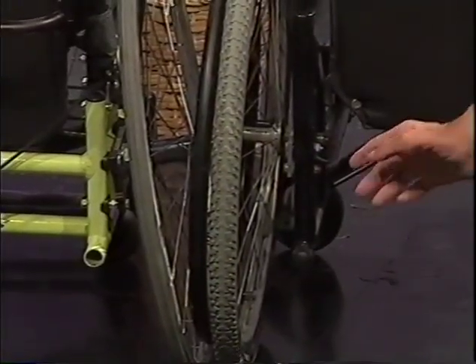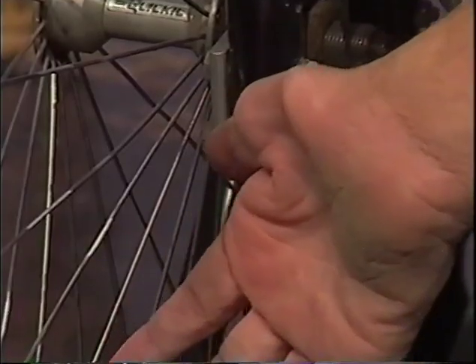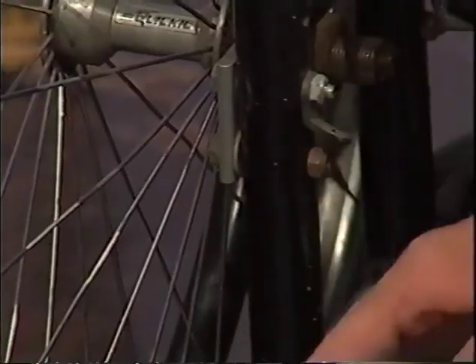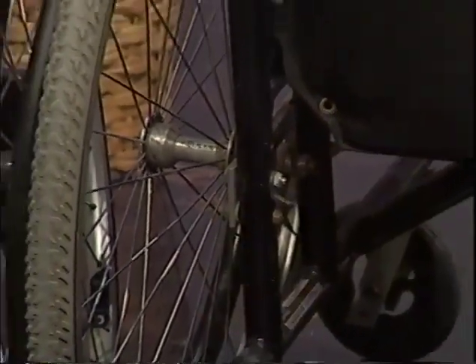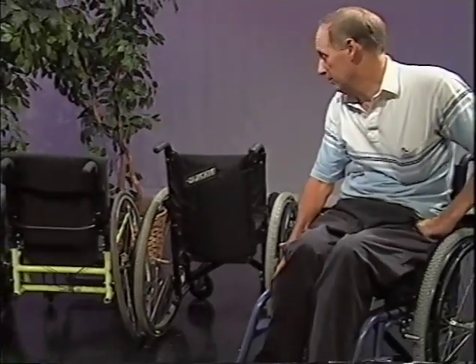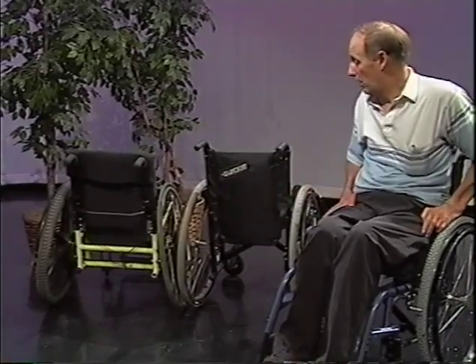All right. On my everyday chair, I only have one washer in between the plate and that gives you about 3 degrees. So for every washer you put in there, you gain about 3 degrees of camber. And 3 to 6 is the normal amount of camber you want to put on a chair. And basically, you're trying to keep the chair narrow for going through doors. You're not trying to have a very hard turning chair. And that's all there is to camber.